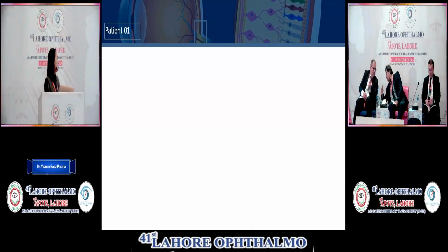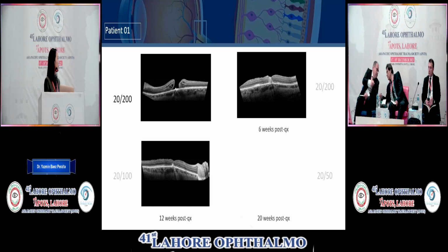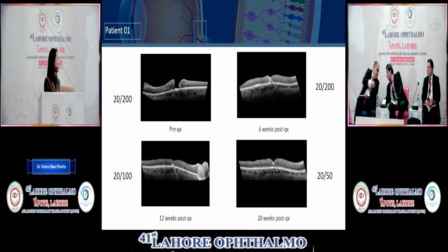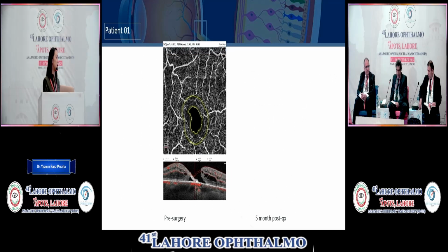We finish the surgery, and here I have one of the first patients, and this is the OCT. We can see that the patient was like 1 in LogMAR, and then it goes to 20/50, that is like 0.4 in LogMAR. Those are 3 cases of refractory macular hole.